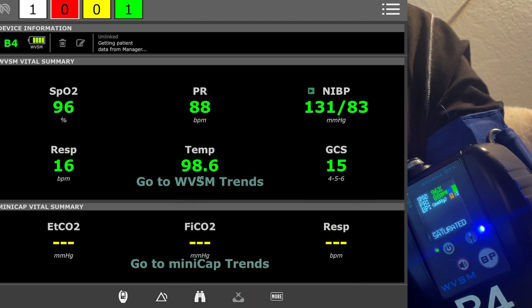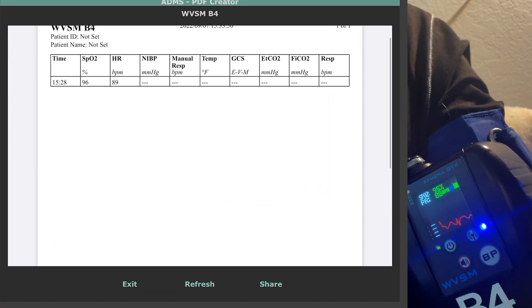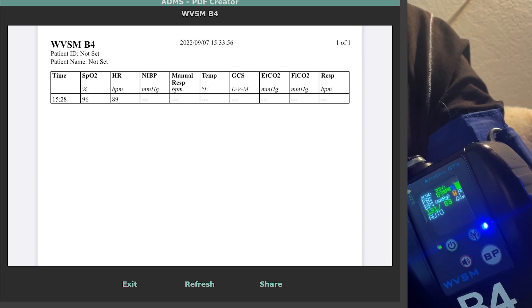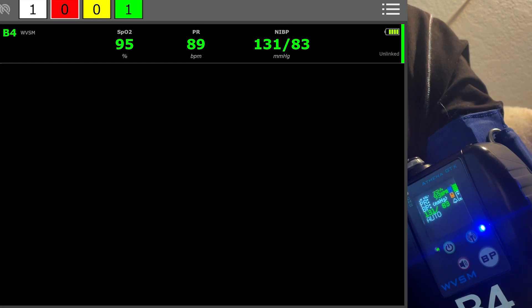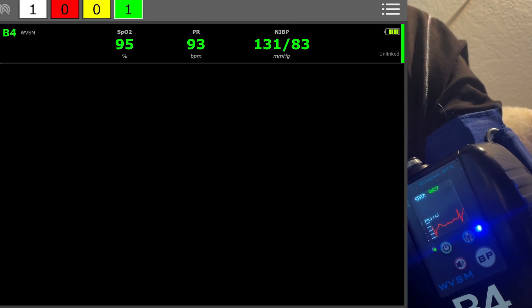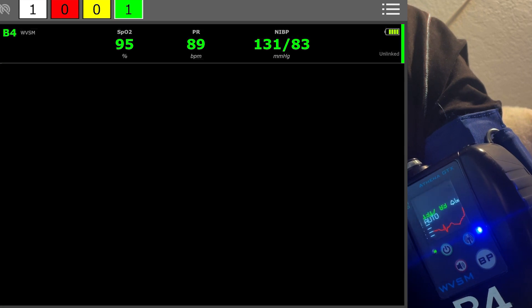You can try the PDF creator and that will actually dump out snapshots for you as well. You can also sort by the different color grading — obviously there's only one device here so it's not really going to do anything, but that is an option as well.